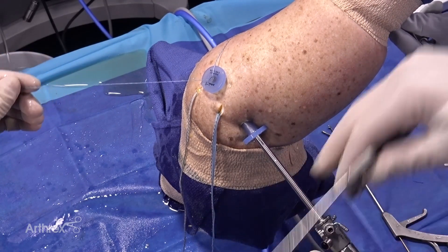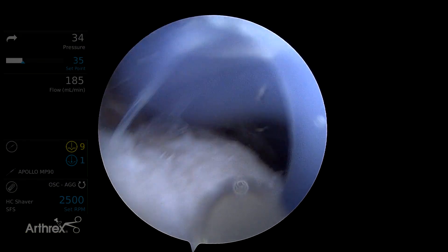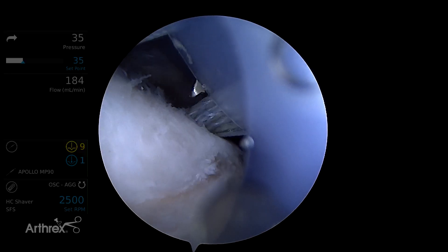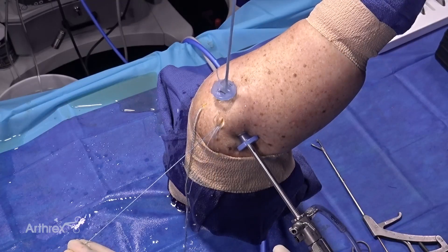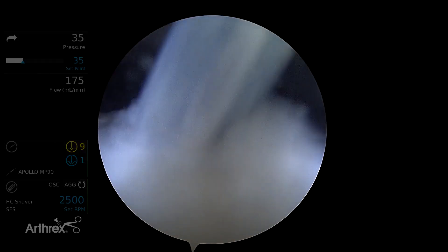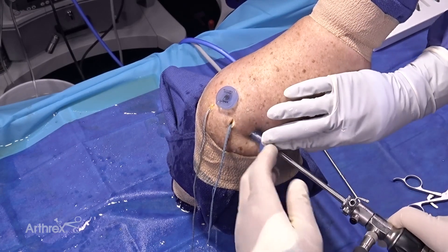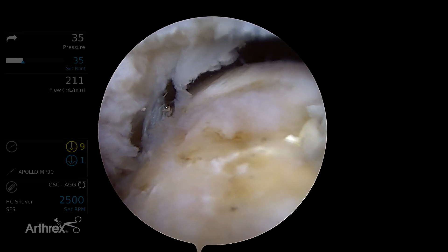We're going to hold on to the looped end of that and bring out the straight end, which is going to be our pulling end. So now we'll use our Kingfisher fiber tape retriever to pull all the tapes and all the sutures out from that posteromedial anchor, and then we'll shuttle those through. Once again we want to pull on these to be sure all the slack is out, and I'm going to look back through the lateral viewing portal just to be sure all the slack is out of those sutures.